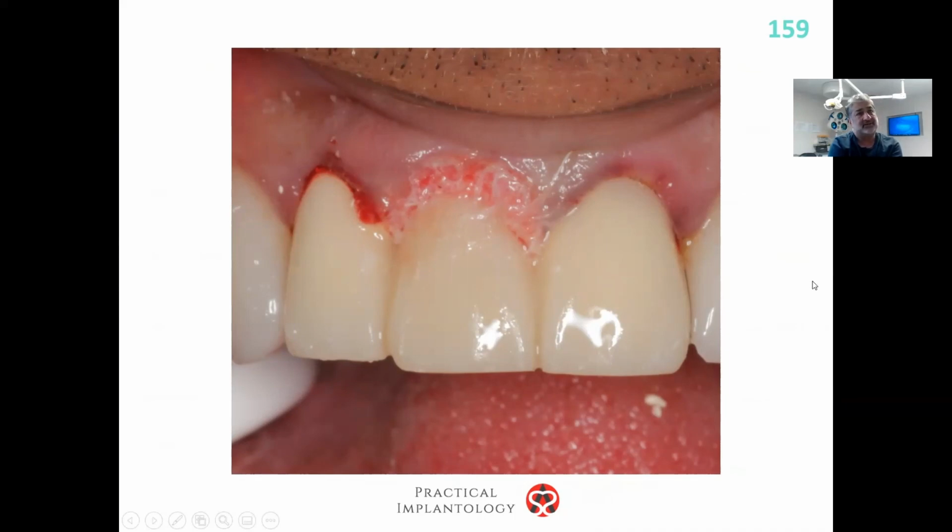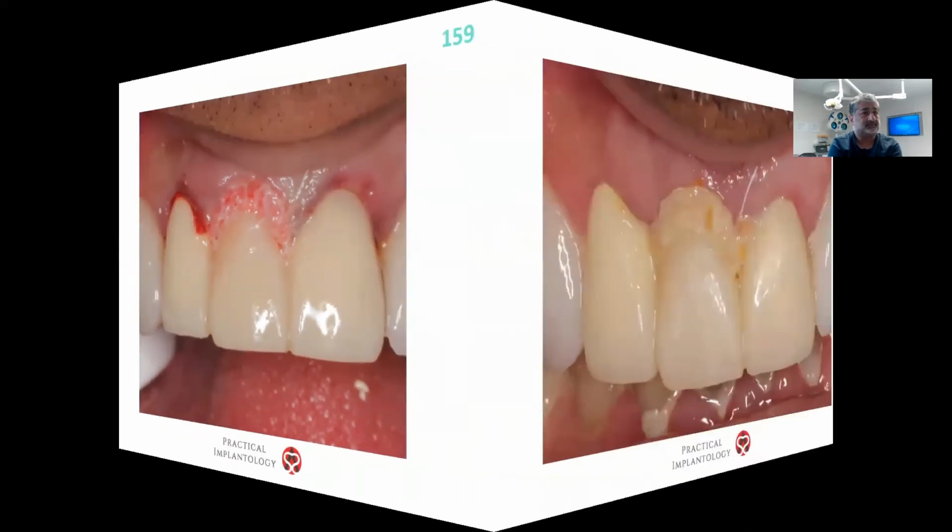Why? Because even though that's a fantastic collagen sponge, highly knitted, it will resorb in 3 days, maybe less. The cheaper ones that you get, the other collagen sponges, won't even last a day. The enzymes in the saliva will remove them, will degrade them.